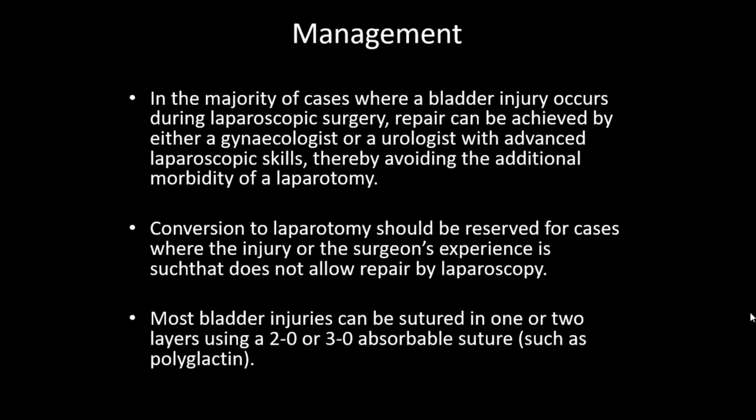But if the question is asking for an imaging modality, let me explain the investigations of the urinary tract rapidly, from upside down. Intravenous urography or intravenous pyelography, IVU or IVP: the main organ you would like to examine is the kidneys.